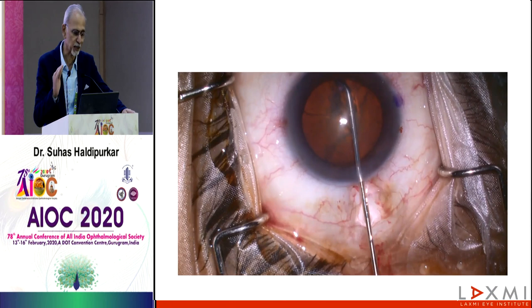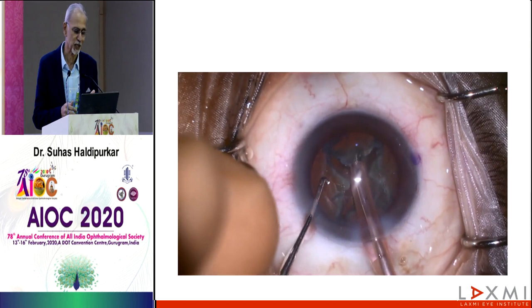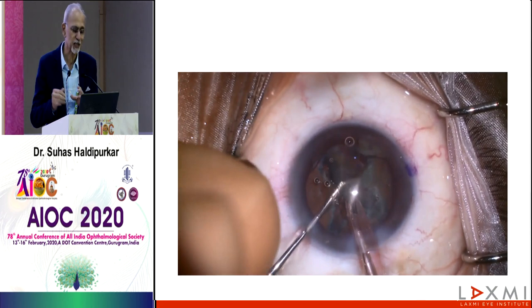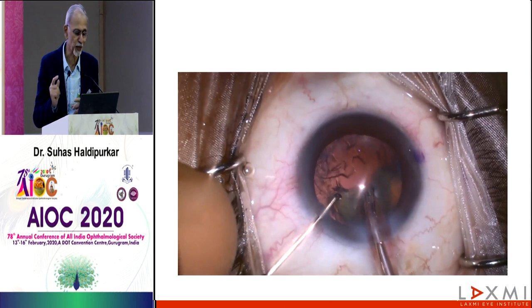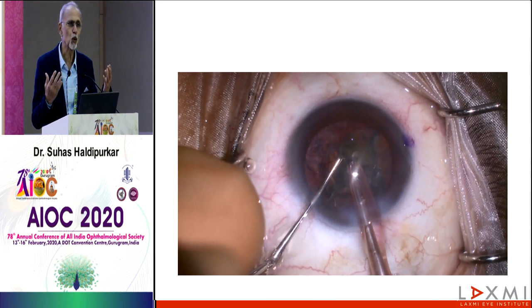Now, what happens is, as a surgeon when you're operating, you're concentrating somewhere else, and your video cannot make that mistake. But by now you know that yes, you are in for disaster, but that was done some years back. Today I would not do it this way. I would stop, inject enough viscoelastic between the rhexis and the nucleus to literally load it behind, so there's no question of the nucleus dropping, and here I'm just waiting for.